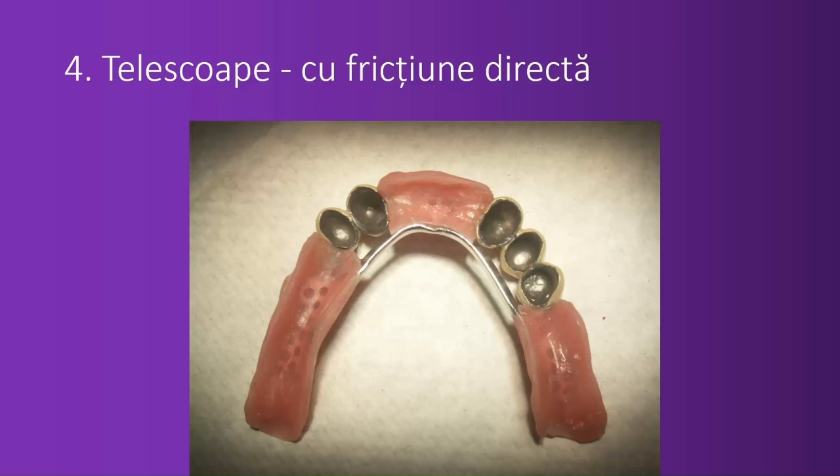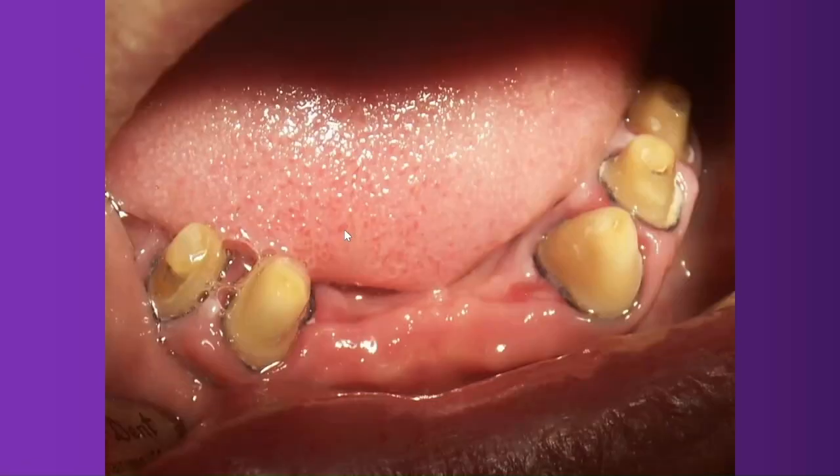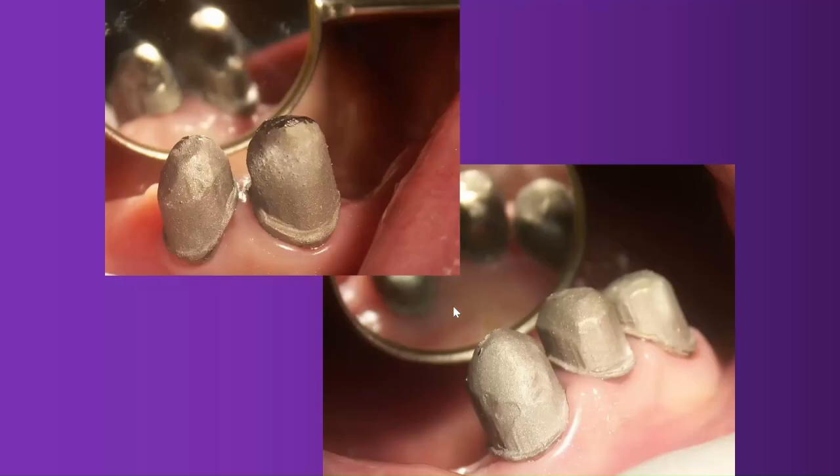The denture that, instead of being a bridge cemented on the teeth, will be placed on the remaining teeth. Those are the remaining teeth. I was not able to take very nice pictures at that time. The saliva shouldn't be there, sorry for it. Those are teeth prepared for impression, retraction, quadrant. These are the primary copings, the primary crowns. There are telescopes in gold palladium.